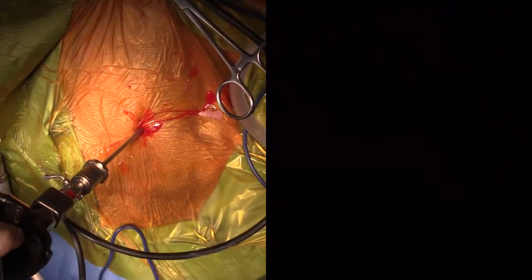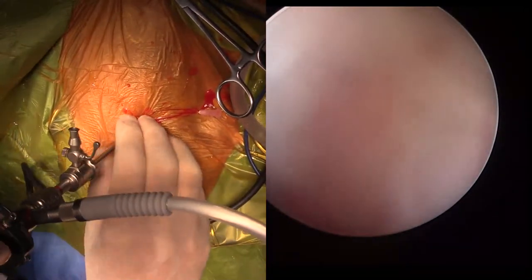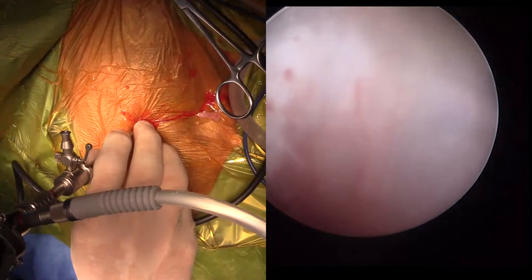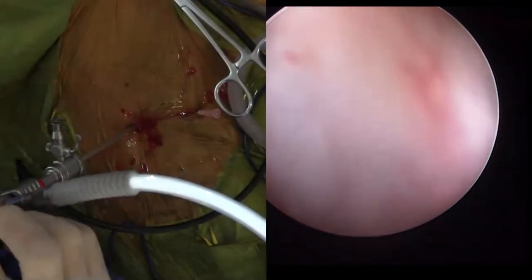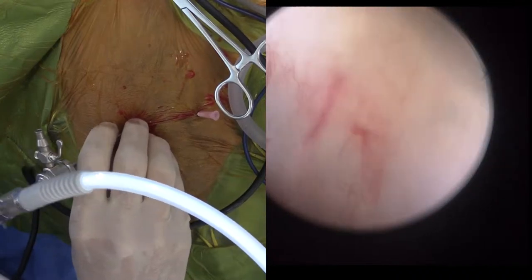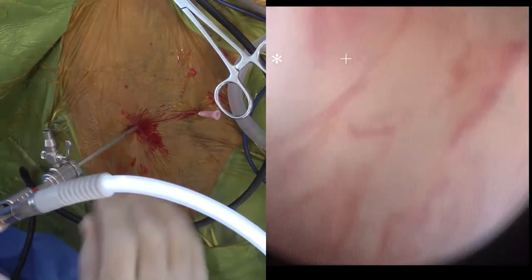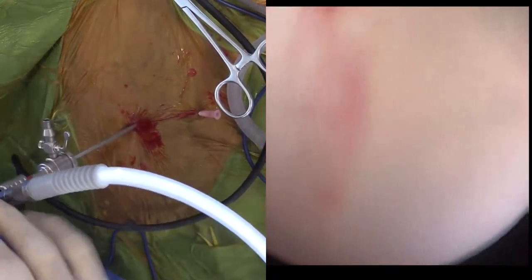I've attached my scope, now I just need to attach my light guide. Can we get the lights turned off? We're into the joint here. One of the coolest things, which is a bit nerdy, is that if you get your scope in the right position, you can actually see red blood cells in the blood vessels. I'll see if I can get the focus right so you can see that.